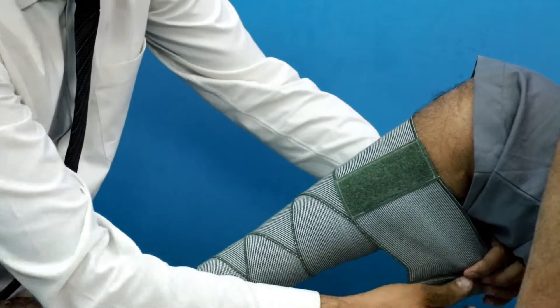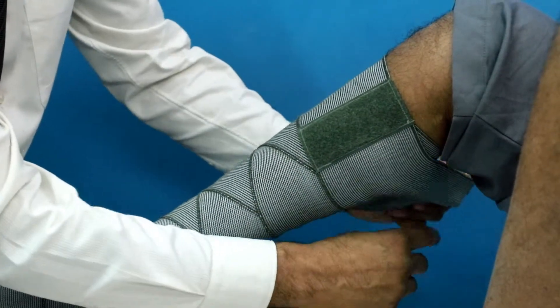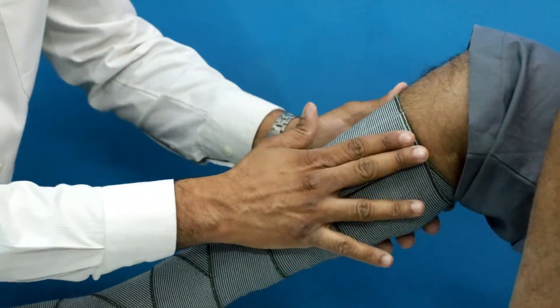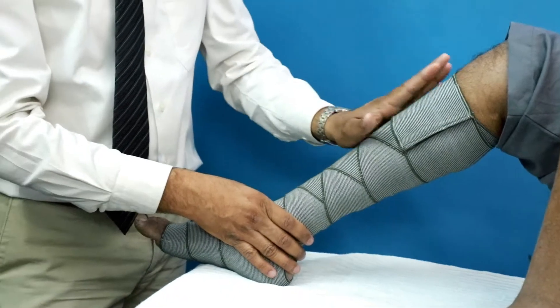This advanced compression bandage comes with a velcro strap which comes just at the right place, and it does not require any clip or paper tape to hold it in place.